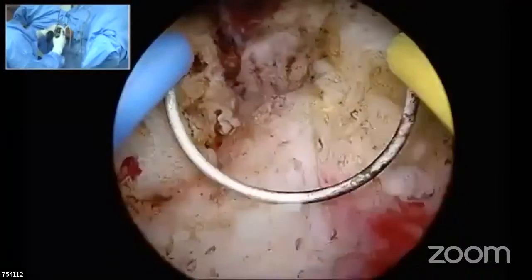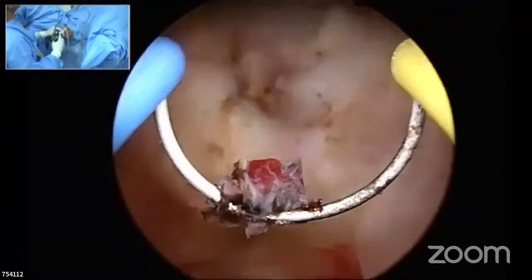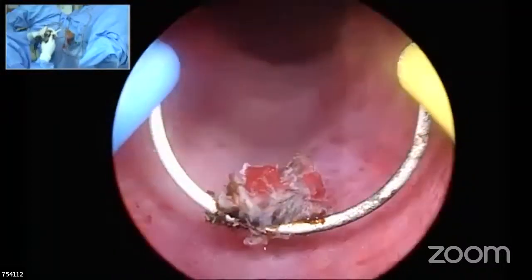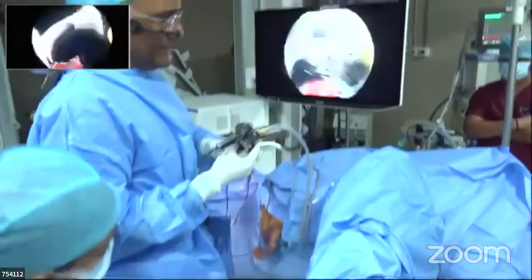A few hours is standard. Yes, sir, a few hours is right, ideal. But if at all people keep it for the next day morning, I think it is not advisable, sir. In the evening I assess and take it out. I'm seeing the urethra all through when I'm coming out and seeing that everything is fine. Now I'm going to put my catheter and see the flow, and then I'll put my catheter, sir.